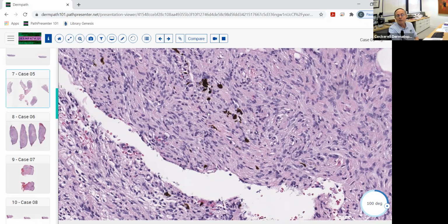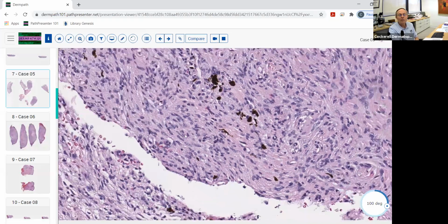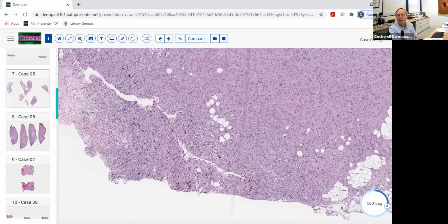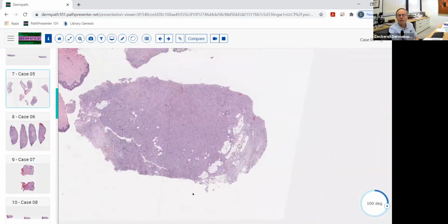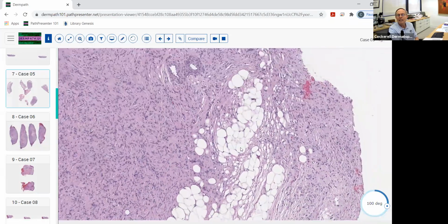It's not really a melanocytic lesion. It just has these melanocytes in them, and they kind of look like these dendritic melanocytes with these sort of thick dendrites here. And the melanocytes are not atypical. It's not melanoma arising in association with this. It's not a desmoplastic melanoma. It's basically just a DFSP with a component of a melanocytic element to it.